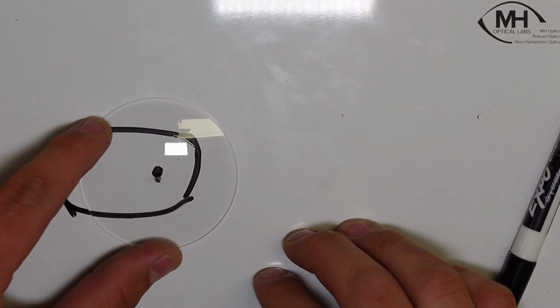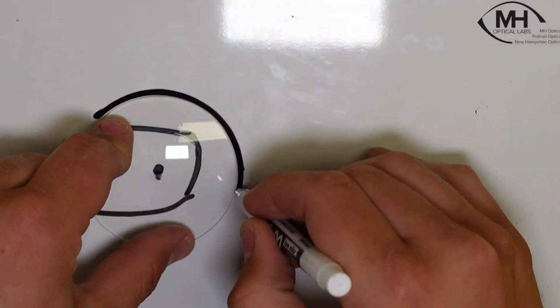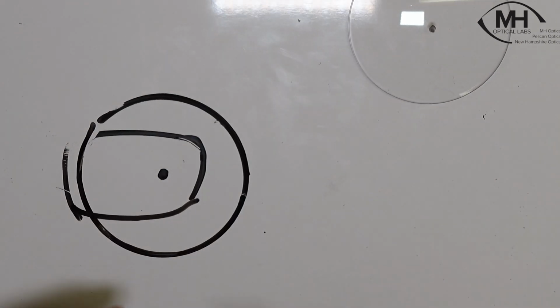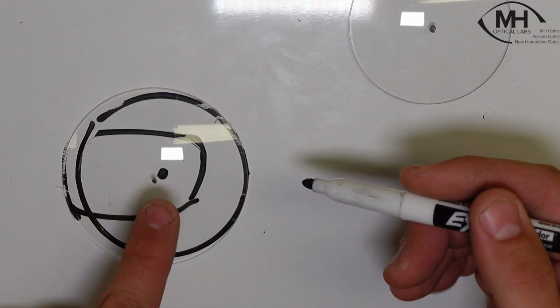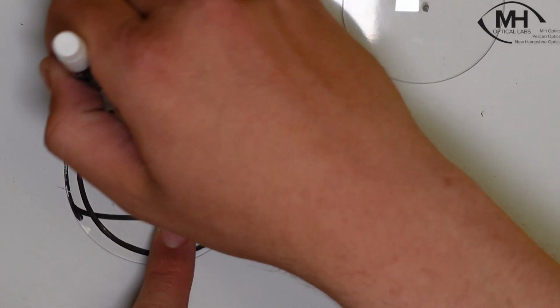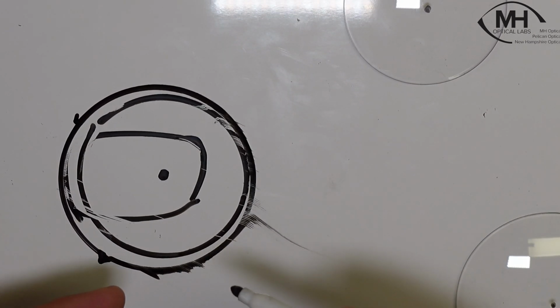We have to decentrate. We can see that this lens is not going to cut out for this frame, and that's 65 millimeters. So what do we have to do? Move up to the next size or two. This is a 75, and we can see we will just make it with this. I didn't do any kind of accurate measurements, I just put the pupil wherever I wanted to, but now we're good to cut out.